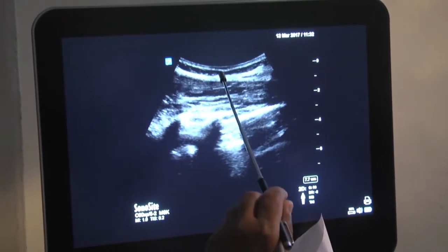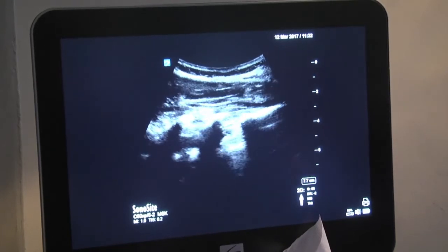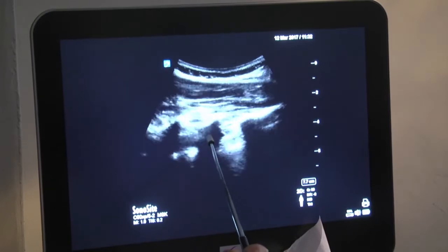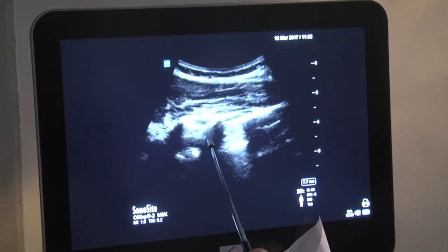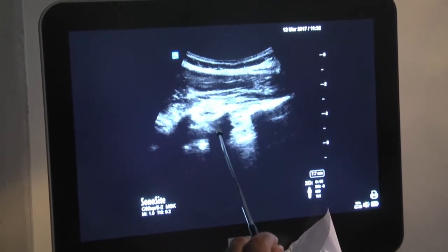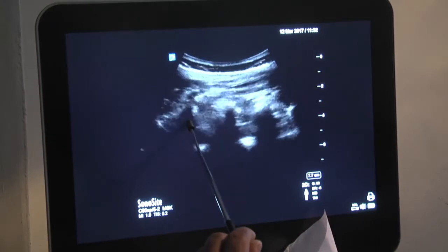Is it? The spinous process should be here, right? Lamina, okay. L5 lamina, okay. So that is like a horse head, okay. So you see the lamina of L5, this is the lumbosacral junction, L5, L4, and this is L3. Can you see?